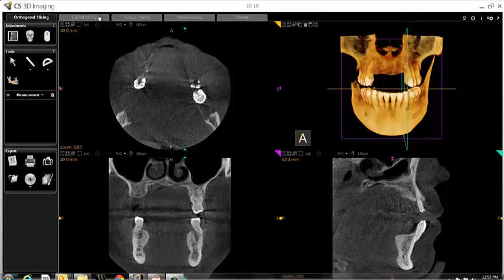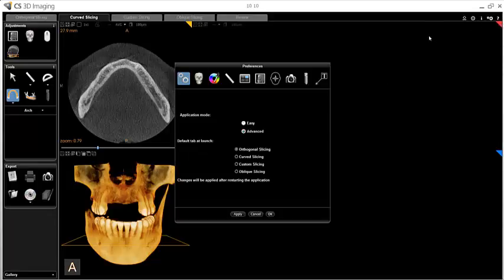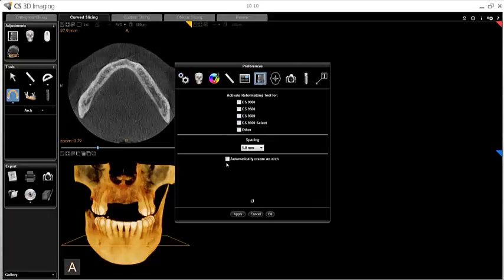Please note there is an automatic arch creation tool which may be on by default. If you would prefer to create your own panoramic images, this feature may be disabled by clicking Edit Preferences, then choosing the NPR option, and unchecking the box labeled Automatically Create an Arch.